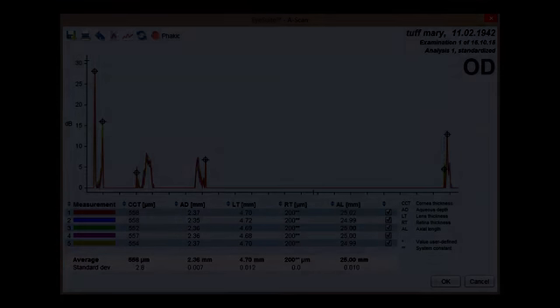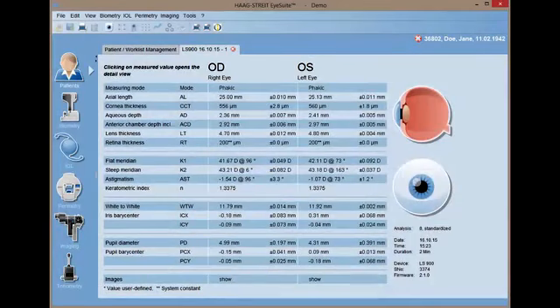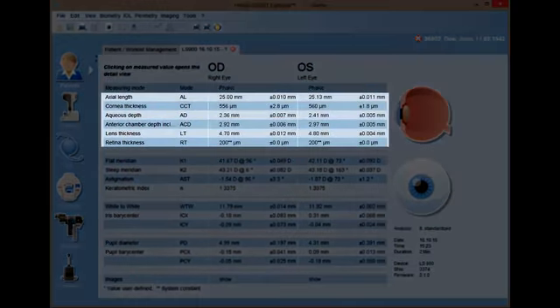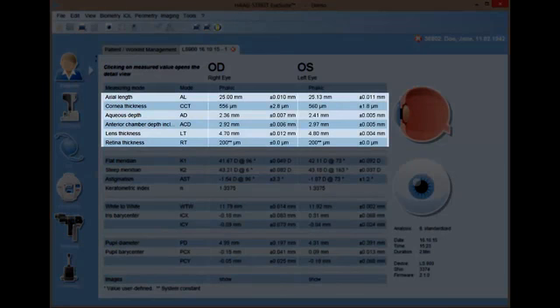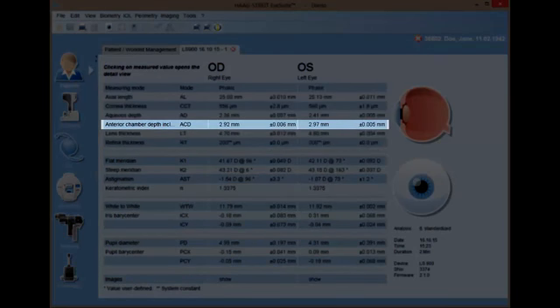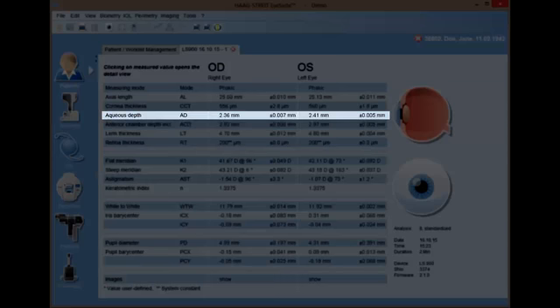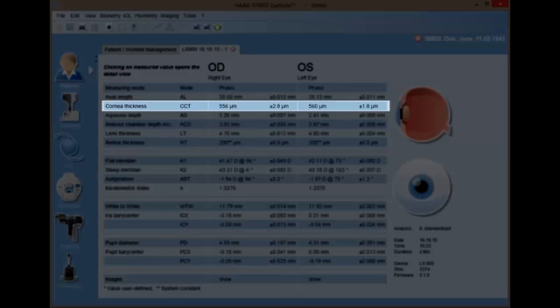All length measurements are displayed in the iSuite results overview page. A specialty is the ACD measurement as it is separated into CCT from the epithelium to the endothelium and AD or aqueous depth from the endothelium to the anterior surface of the lens. AD and CCT measurements are separated to grant the user the capability of independent analysis.